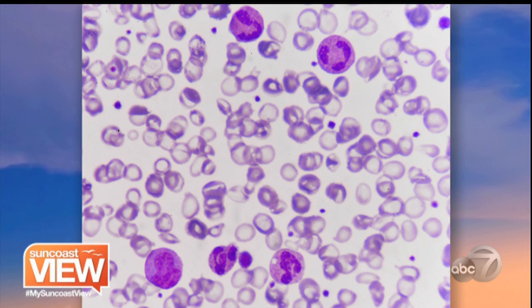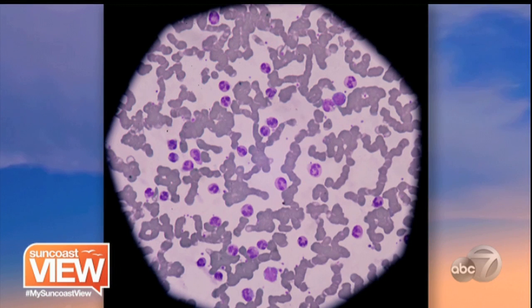So a patient comes in saying, you know what, I have low energy, I can't sleep, my bones ache, and I'm like, well, you're anemic. The moment I look at their cells, you can tell. And then those bigger circles, those are the white blood cells. White blood cells are so important to protect the body from different types of funguses and diseases.